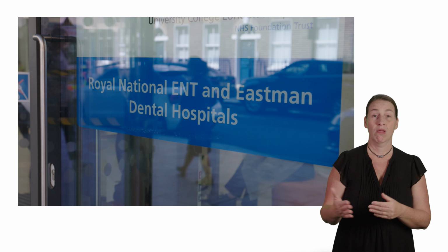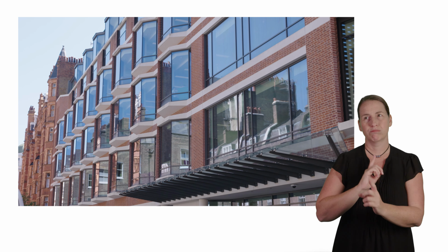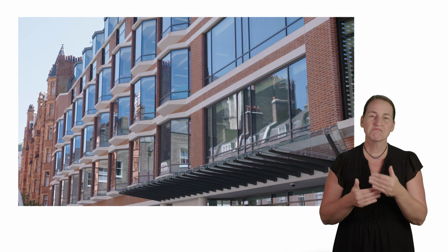Generally, people who have a shorter duration of profound deafness tend to do a little bit better than the people that, let's say, were born with profound deafness. Having said that, if people fully engage and listen to the team and the advice that we give, they tend to move along their journey more smoothly. So at the beginning, there are a lot of appointments and you're coming here all the time. But then as you get used to wearing the cochlear implant, then those appointments space out. Then you'll be seen 6 months after your surgery and then a year after your surgery.